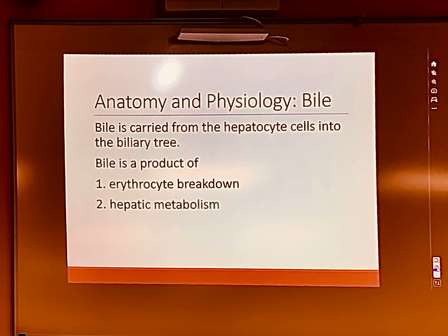So when your bilirubin is higher, your nuclear medicine study is going to reflect exactly what's going on inside. You are going to have a funky looking picture with a liver, and it's not going to do a whole lot. So it's important to remember, we are physiological imagers. We only see anatomy because of the physiology of the organ, and this is true for every single organ that we see in general nuclear medicine.